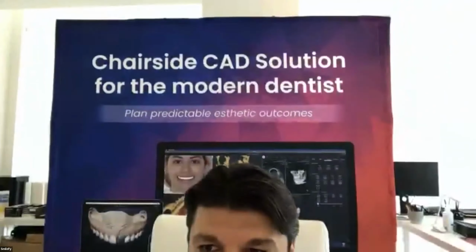As you can see here, finally, we pushed limits again, and I can present you today something that is very special. It's the highest level of development that we have created so far. And it is unique.